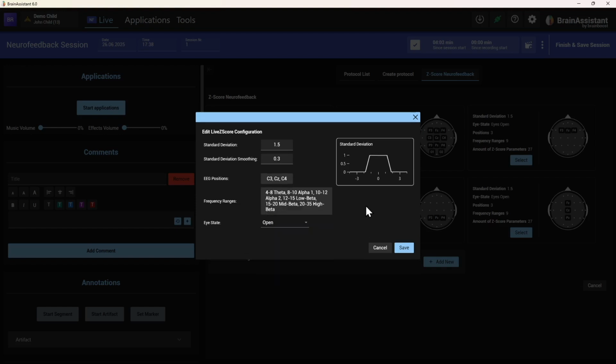Of course, it kind of depends. So if we're here now at 1, 2, 3, 4, 5, 6, 6 times 3 is 18. I would try to get to at least 20 parameters. Now it gets interesting. I mix them together and say, okay, on these 3 positions times 6 frequency bands, I'm either, let's make this a 0, I'm either within 1.5 or outside 1.5 standard deviations.